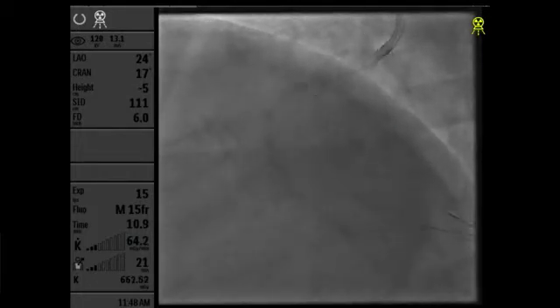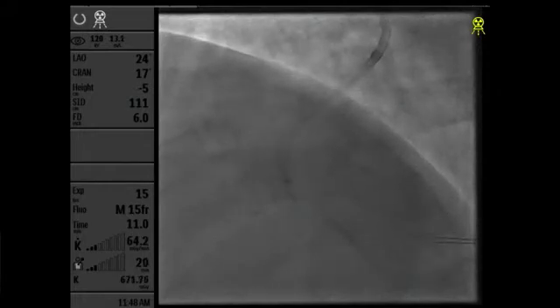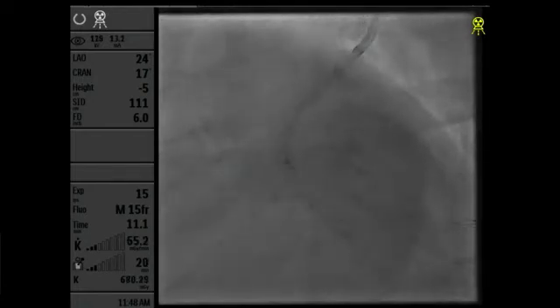What about the concept of kissing shockwave balloons? Right, you pass now the lesion. You pass through 100%. You pass the lesion. So I'm going to back my guide. You see why you can advance it? Yes, that's the reason. Very nice demonstration. That's exactly the point. That's why we said pre-dilatation would be the best, and then move with the shockwave.